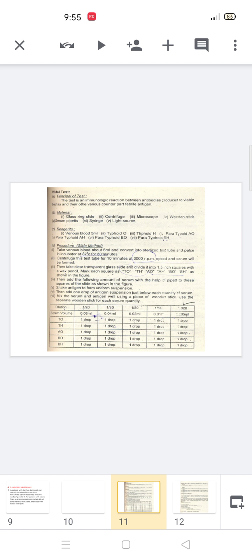And the other diluted serum, if it does not show the turbidity or the clumping, so we say the test is negative. The borderline is the 1 by 80. If the turbidity or the clumping is observed, we can say 50-50, it is positive or negative.